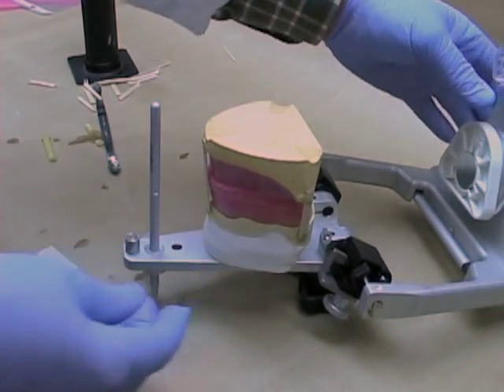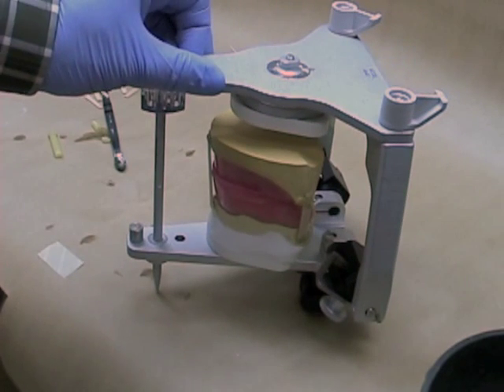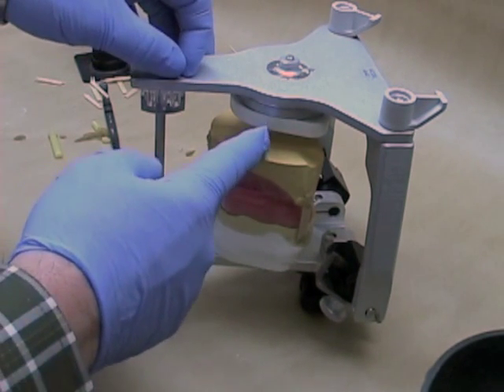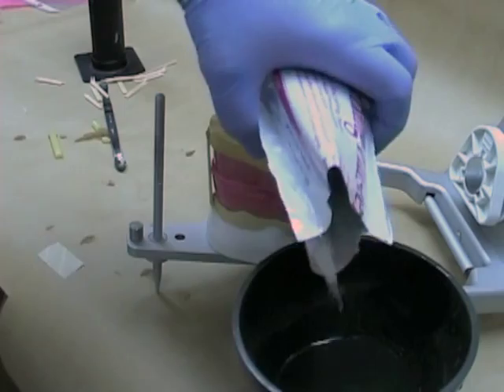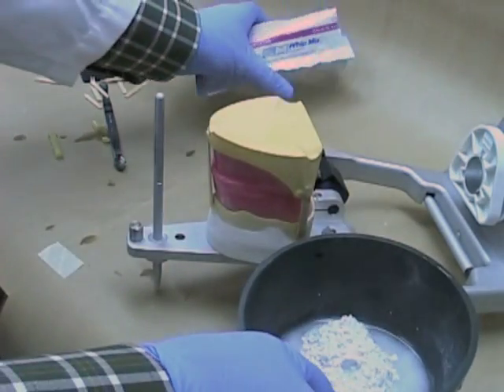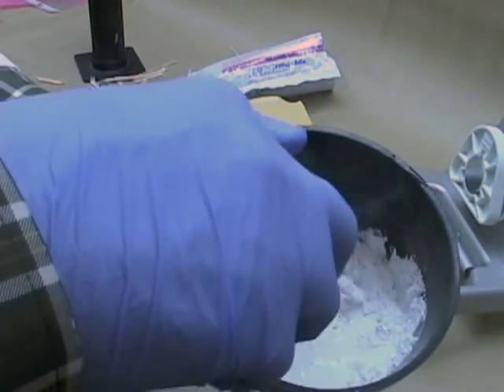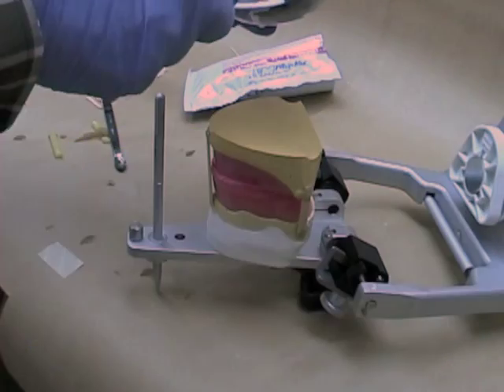Invert the articulator and make sure it's stable. Then close the lower member of the articulator and make sure you've got sufficient room between the mounting plate and the cast. Mix your mounting plaster similar to how we mixed it in the maxillary cast — about 50 to 55 milliliters of water to the powder.